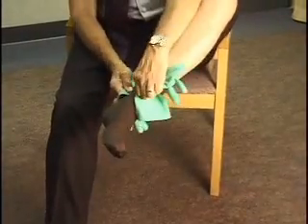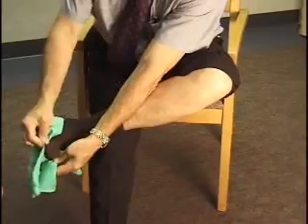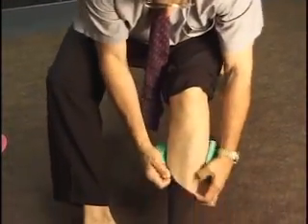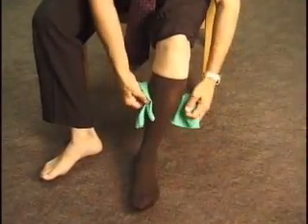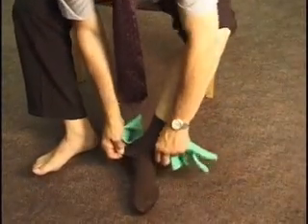Then the stocking is pulled over the heel, but gloves are used to facilitate the process at this stage. The reason for this is not to tear the stocking with a fingernail or pull it with undue pressure that would shorten its life. Then the stocking can be smoothed out, including straightening out the toe. You will see here that pinching the stocking without the gloves is very difficult compared with pinching with the gloves.